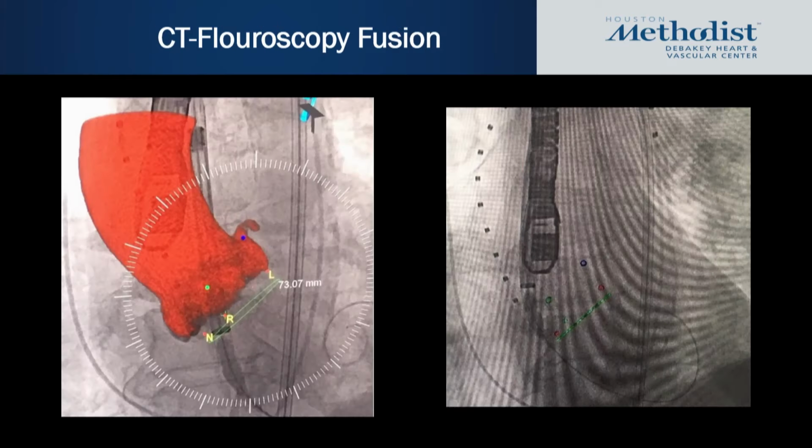In this same patient, because we're trying to protect the kidneys as much as possible during the TAVR, we used CT fluoroscopy fusion. That's a different patient. So that patient had a CT actually during the time of the TAVR procedure, a dynamic CT. We got the annular markers, and we can overlay the CT markers on the fluoroscopy to aid in valve deployment with minimal use of contrast.